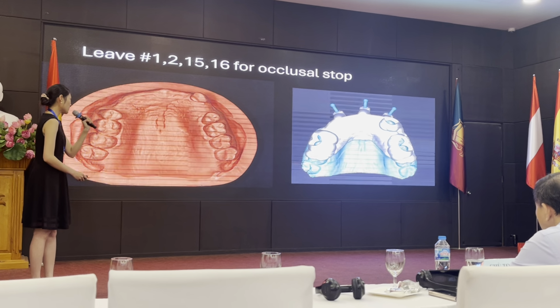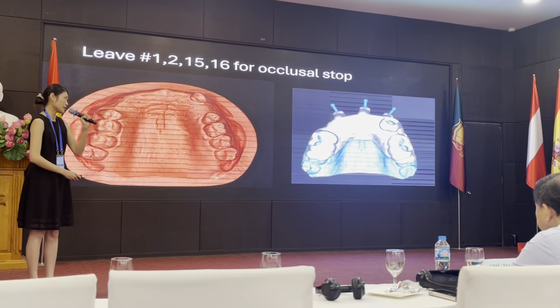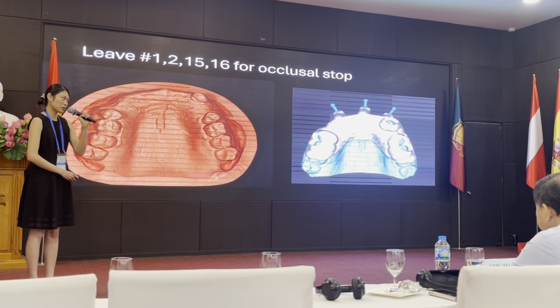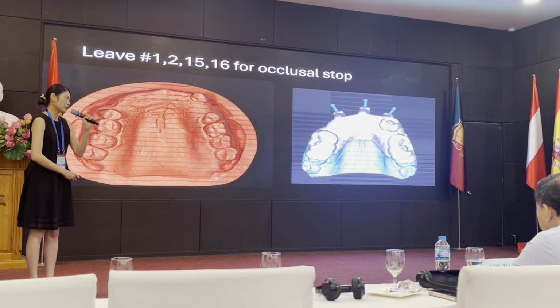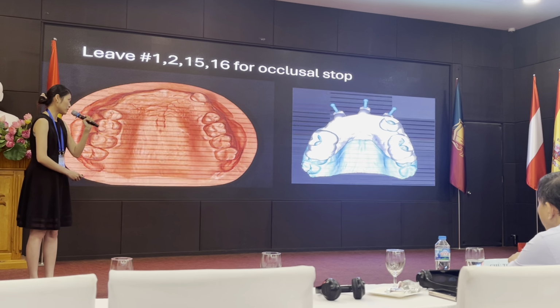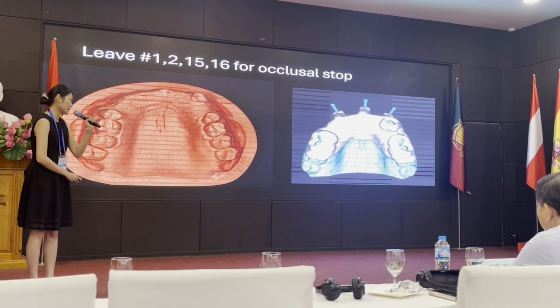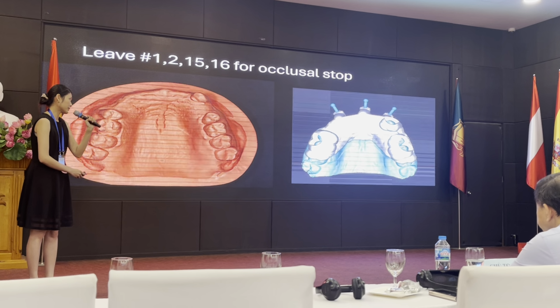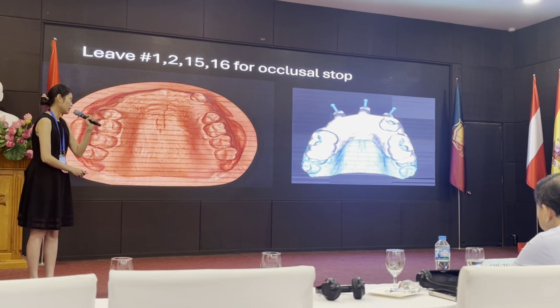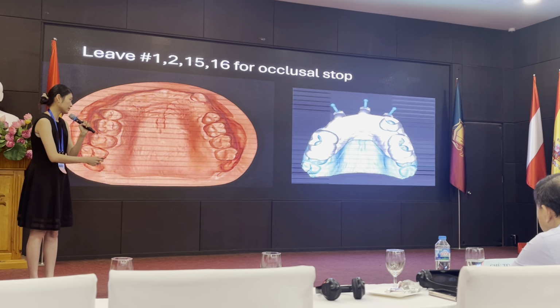And in this case, although we decided to go with the complete arch fixed implant prosthesis, we still want to keep the vertical dimension during the treatment, because the implant is still healing, so you don't want too much force on it. So how we decided that was we decided to keep the third molar in place. We are not extracting it on the day of surgery. And then here we have the anchoring pin, and we designed the tooth-supported implant surgical guide.